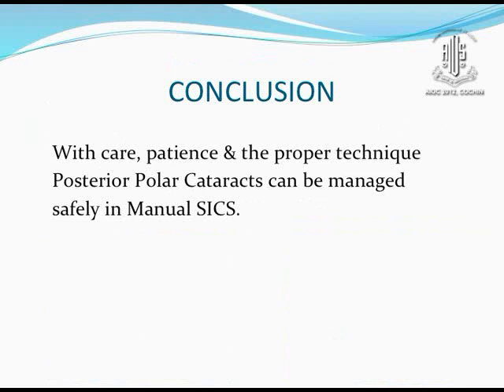With care, patience and proper technique, posterior polar cataracts can be managed safely in manual SICS.